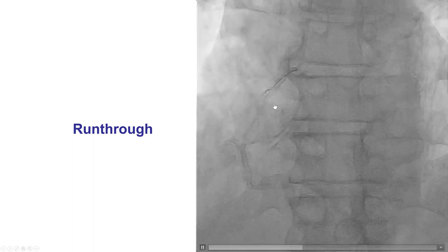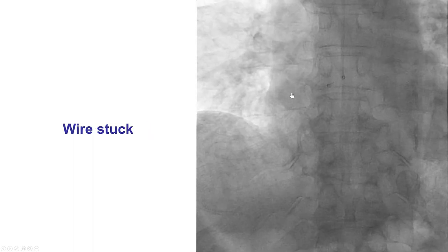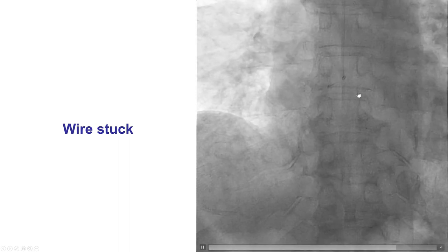Wiring was challenging. A run-through wire was used this time, and then upon withdrawal of the wire, the wire became entrapped in the proximal portion of the right coronary artery stent.